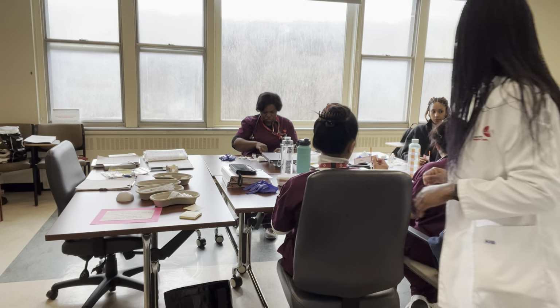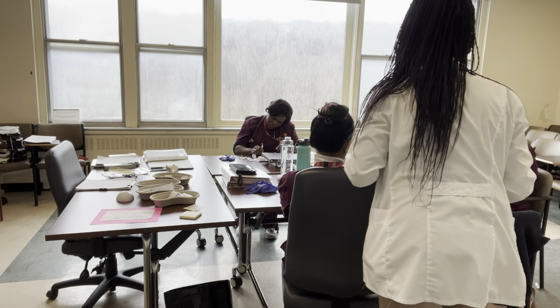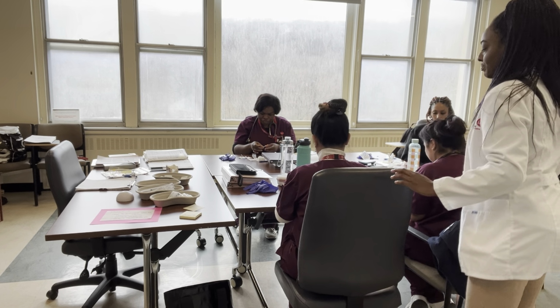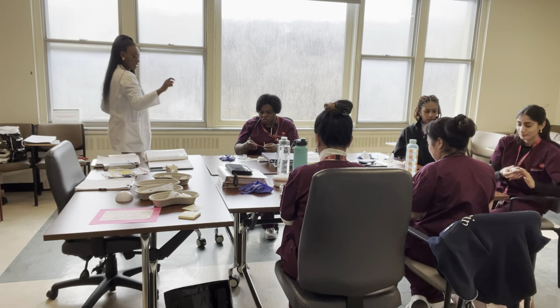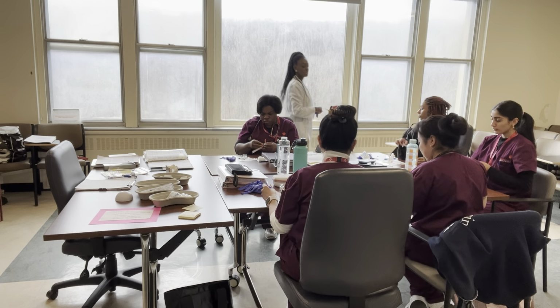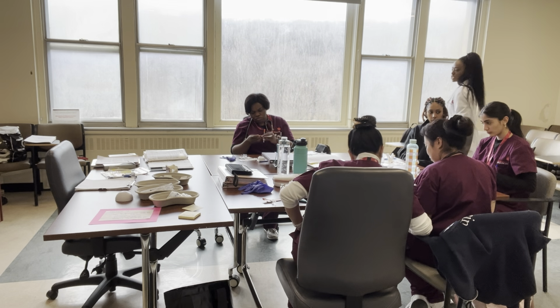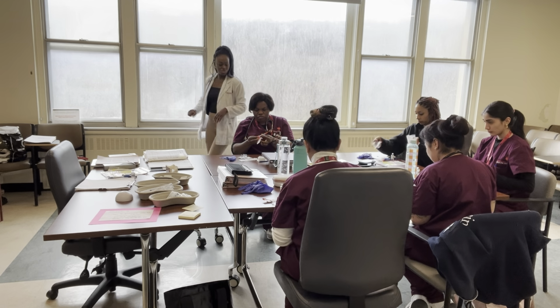Okay. So be careful with the needles. Do you have a 2x2? Take the 2x2 that's right in front of you. The 2x2, darling. Put it on your finger. And then don't take the needle. It's your blood, so you'll pick up the syringe after, but put pressure. Is it bleeding? No. Oh, it's not bleeding? Oh, we'll just put pressure anyways, just in case. So you'll leave yours down. Get rid of your garbage, and then we'll start to do the injection part.